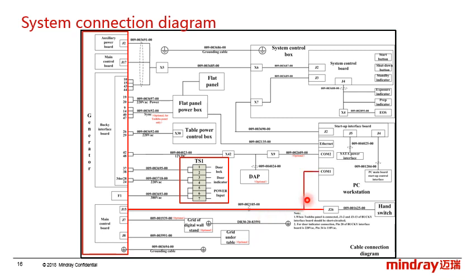And the J15 connector, like I said before, is used to communicate the generator with the PC and the hand switch. If this connector is not connected, you will see the GA error displayed in the DROC.